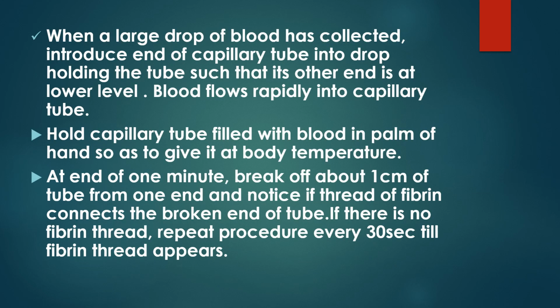When a large drop of blood has collected, introduce the end of the capillary tube into the drop, holding the tube such that its other end is at the lower level. Blood flows rapidly into the capillary tube. Hold the capillary tube filled with blood in the palm of the hand so as to give it body temperature.